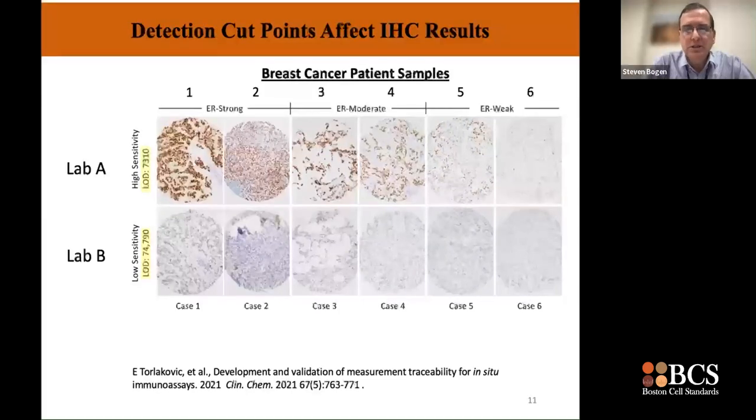In fact, from a tissue microarray containing 80 different patient samples in this particular national survey, there were a handful of tumors with estrogen receptor concentrations between 7,000 and 70,000 per cell. These are the ones that are positive at Lab A and negative at Lab B. This was the first broad national survey that incorporated IHC calibration in explaining differences amongst IHC laboratories.